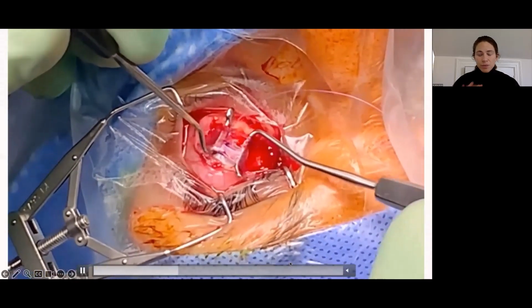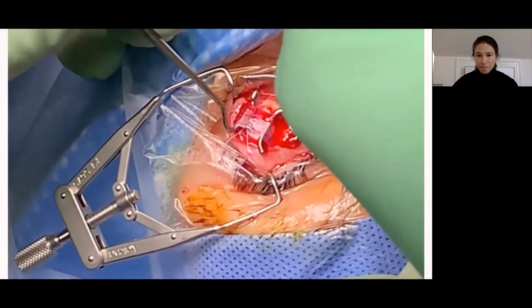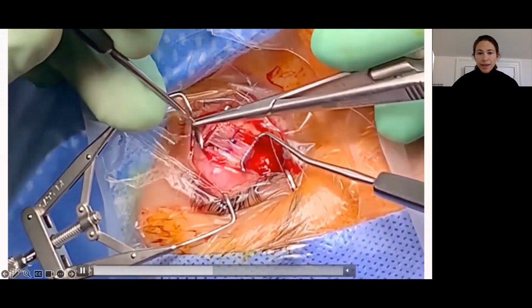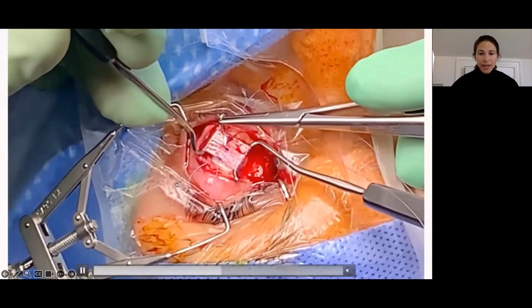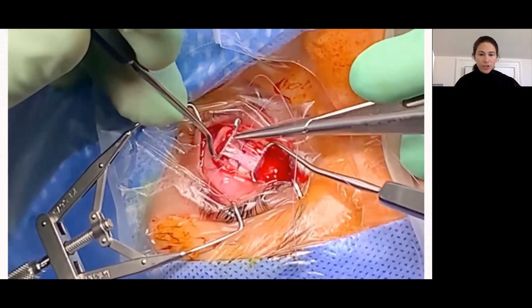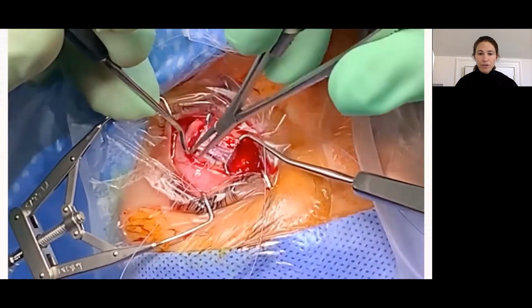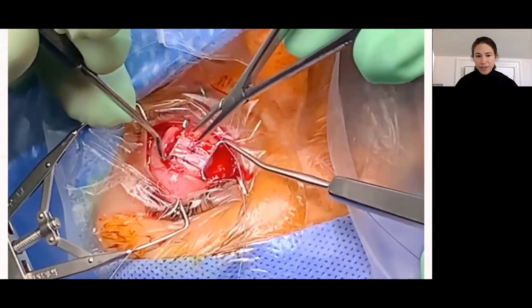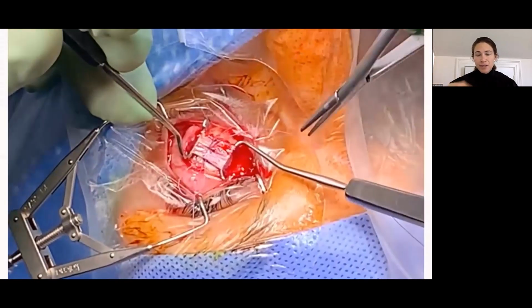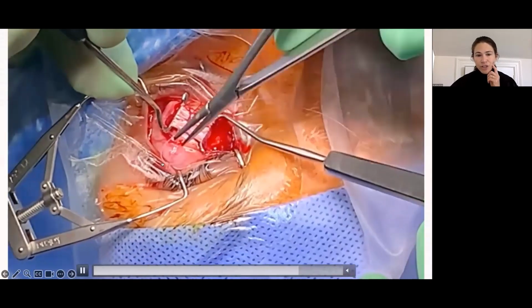And what that does is, in the second pass, it's more superficial, I'm just skimming underneath the ciliary arteries. And that way, I'm setting myself up to do a full thickness bite, again, through that same hole in the center of the muscle. And I've left this loop to lock it with. And you're going to see now, taking that original hole, and I'm going to pull it through that loop that I've created with that back and forth partial thickness pass. Usually we just do one partial thickness pass, but then we did a second back to set ourselves up to lock it.